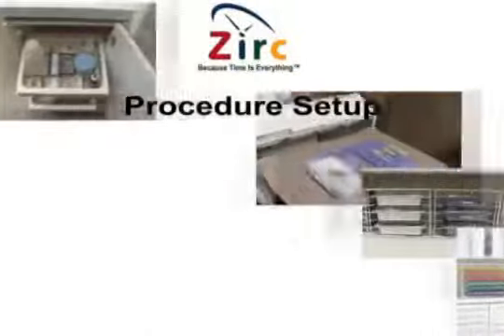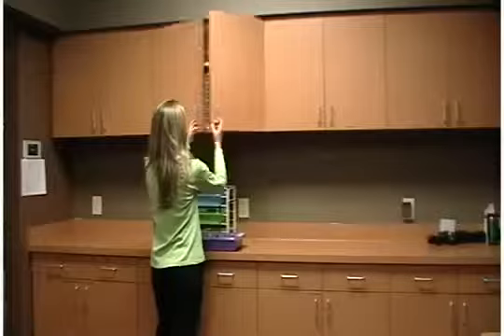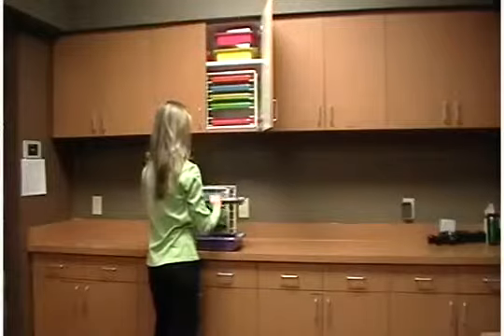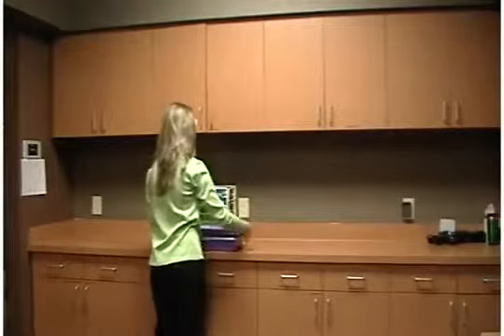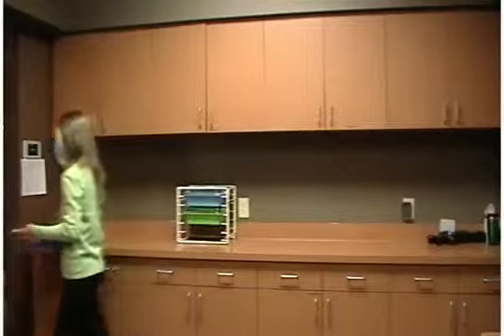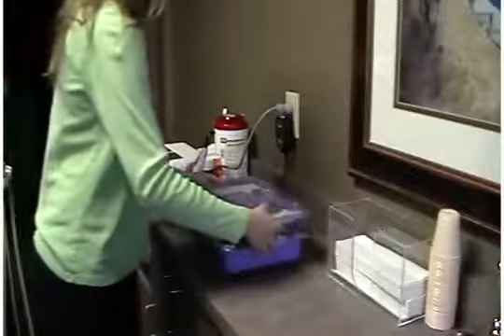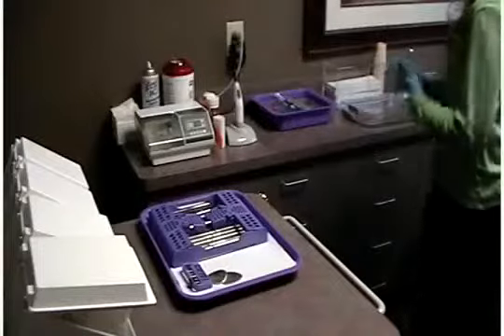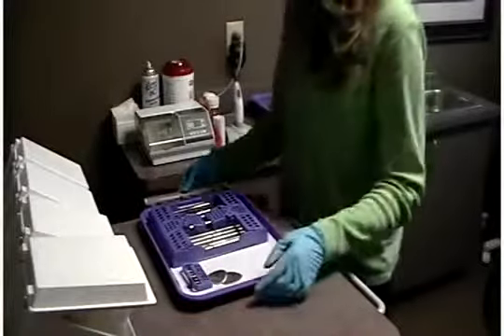Procedure setup. When you are ready to set up an operatory for a procedure, simply pull the appropriate color-coded tray and tub. Your procedure tray will already contain all the instrumentation for that procedure, and your tub will have all the procedure-related materials needed. Zirc considers the tub and tray to be like the dentist's toolbox because it contains all your procedural items in an organized container that you can easily carry to the operatory without worrying about any items being left behind.